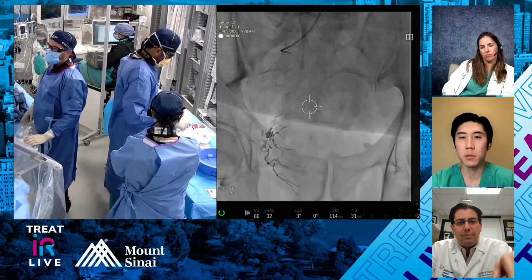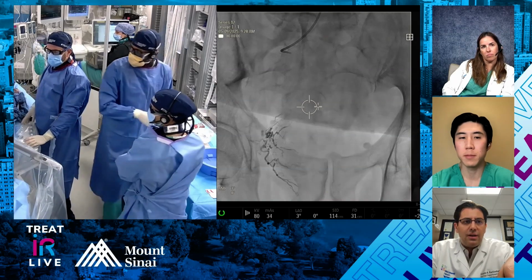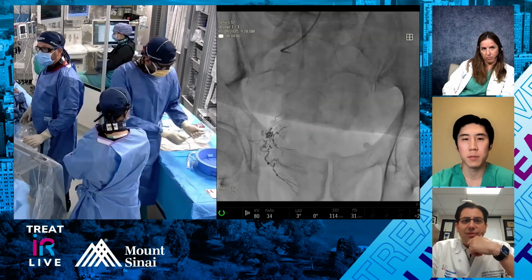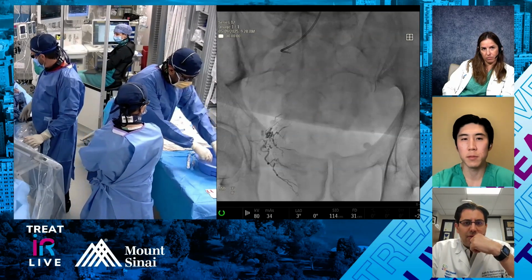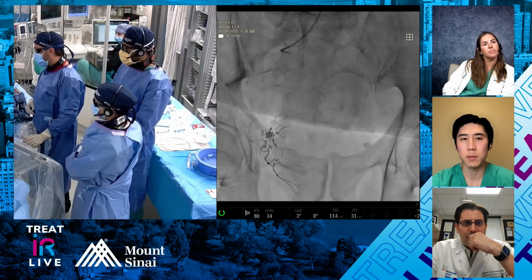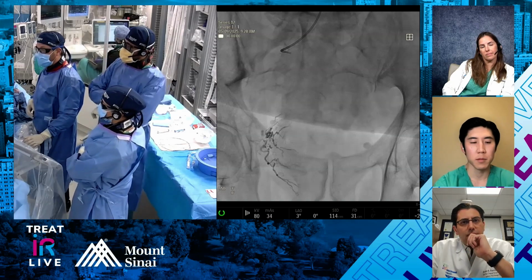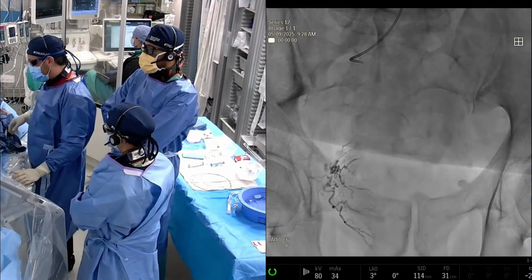But I want to say on the back table, are you guys cleaning your sniper so you can reuse it for the other side? Yep, we just prepped it again. We flushed it very quickly with D5 as soon as it came out of the patient. A couple of times we backloaded it with the wire to try to clear out the liquid embolic. After we pass the wire, we flush it again, and then flush it again with D5. That allows us to pass the wire without having to worry about any liquid embolic that's stuck in there. It's not going to behave like it does on the first side.